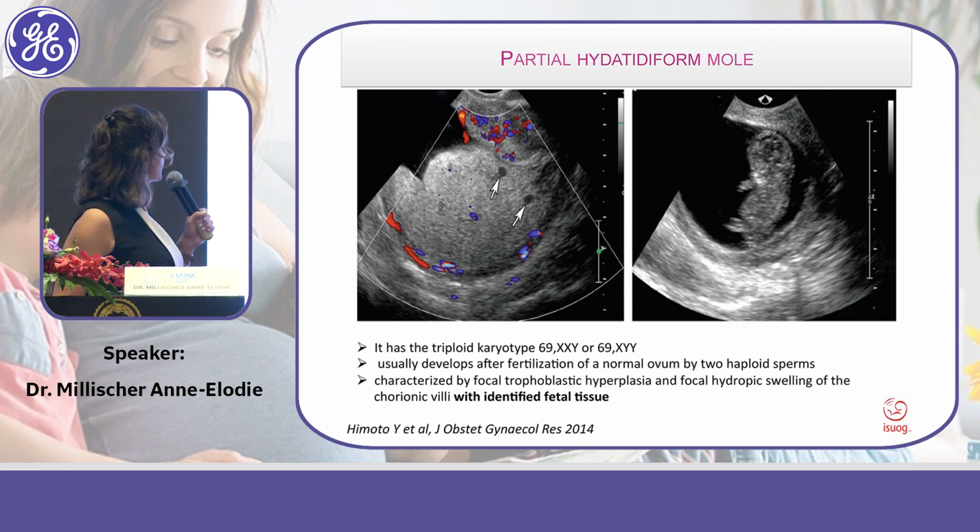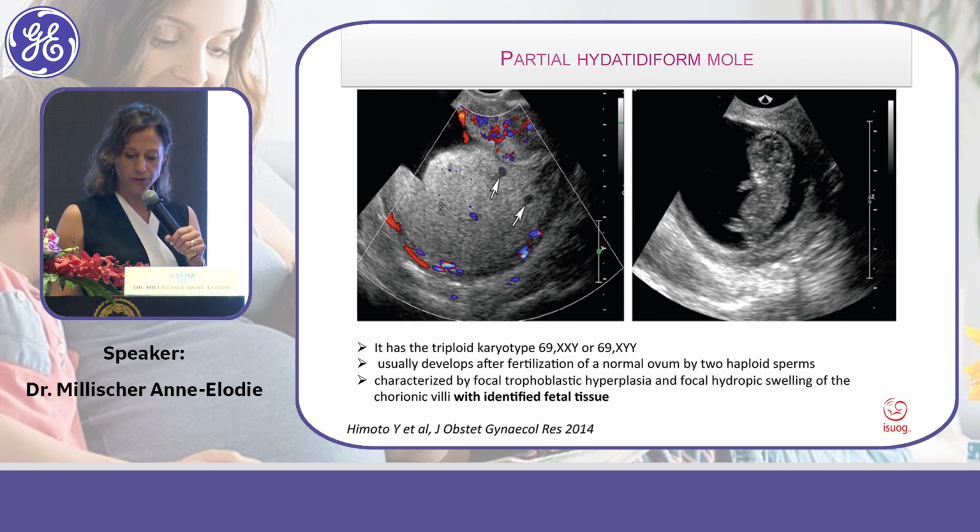Okay, so you have the aspect of a mass with less cysts than the previous form.